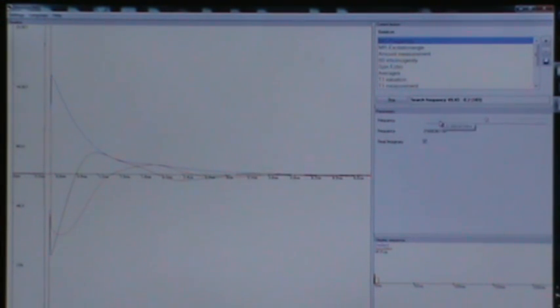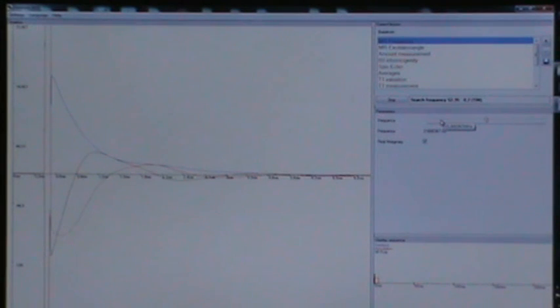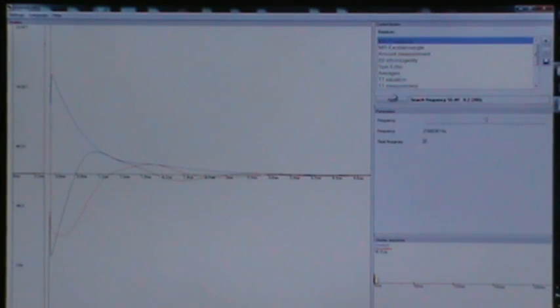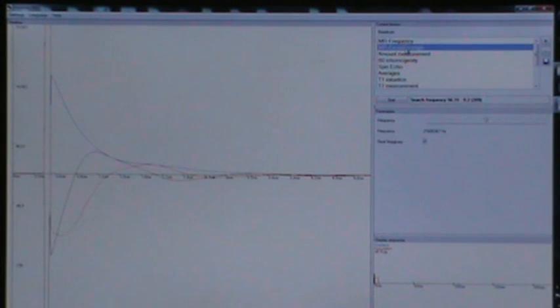Third, select the experiment called MR excitation angle from the experiment section. Start again your measurement.